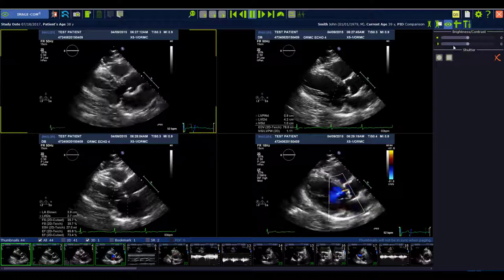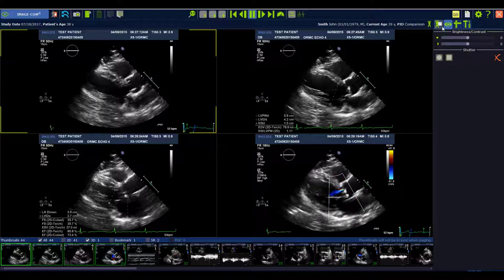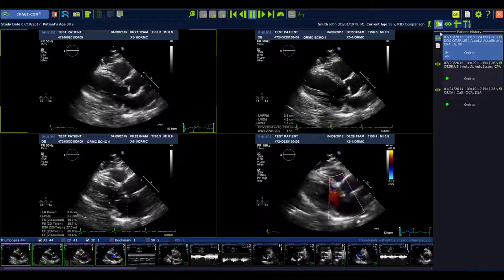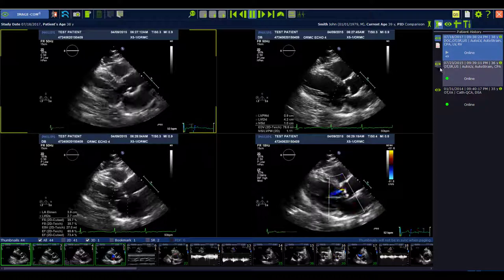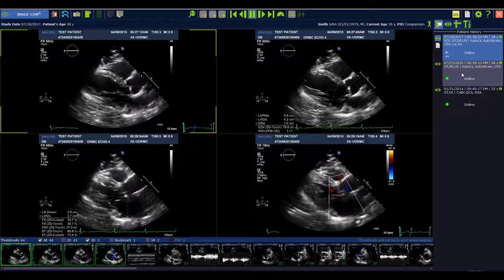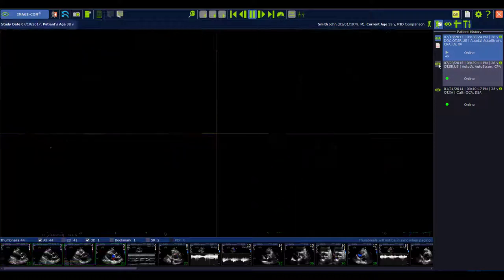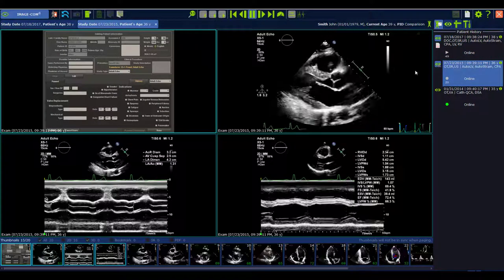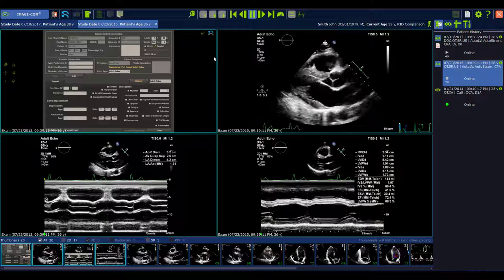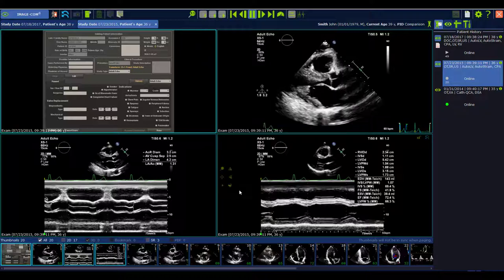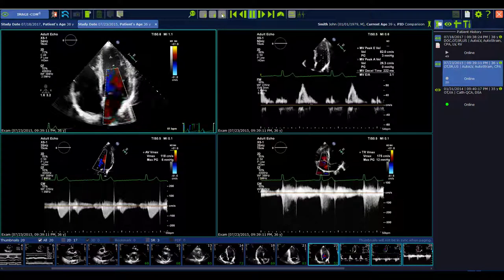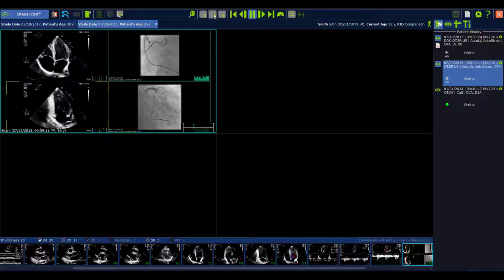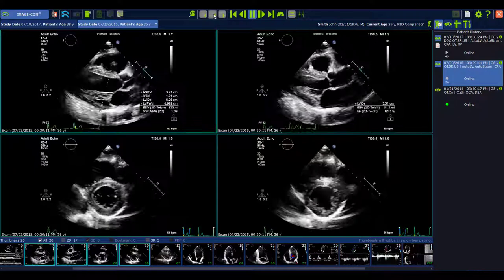In ImageCom, the secondary study review has changed. If you go to the patient history, you see the active study and the old study, and both have this green eye. If you click on the green eye, you can load the old study in the DICOM viewer area. The blue frame shows that you've loaded an old study, and you can scroll back and forth through the complete study and watch all the images without dragging and dropping them from the thumbnail bar.